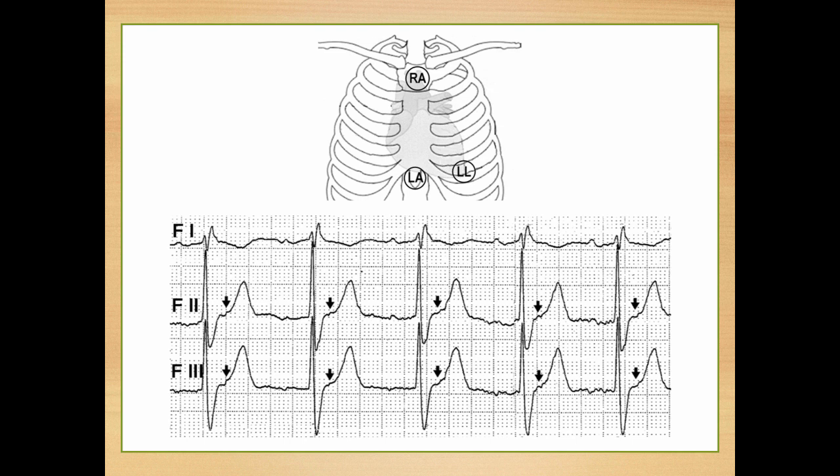That's because they're pointing out epsilon waves. So an epsilon wave is going to be a little fluctuation, an actual puddle wave, ripple wave in the ST segment that leads us to a very particular diagnosis.